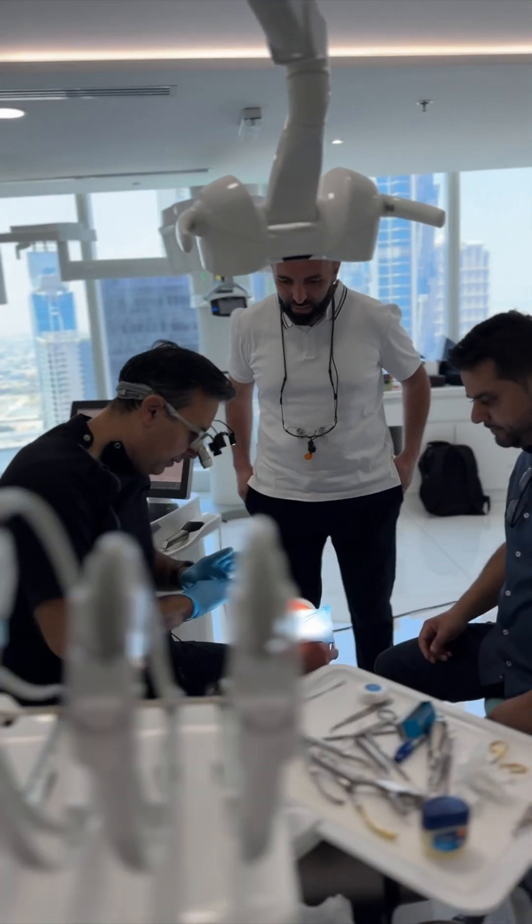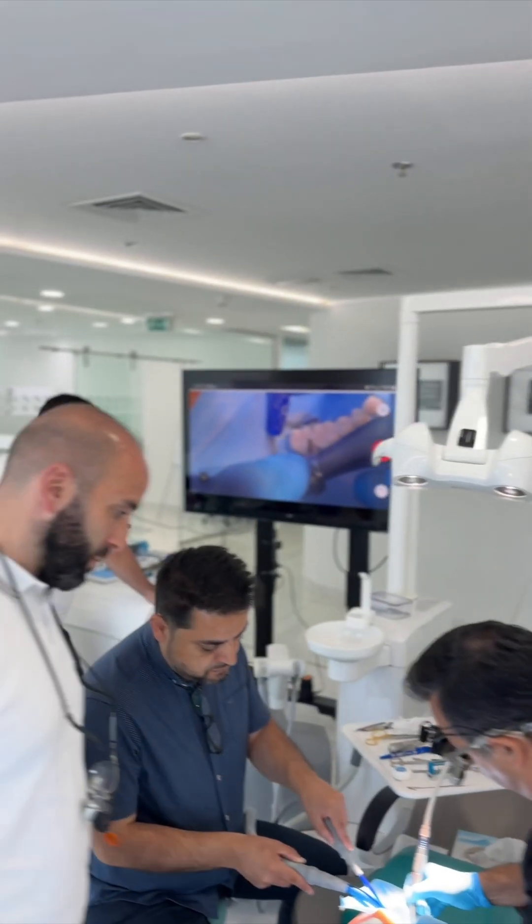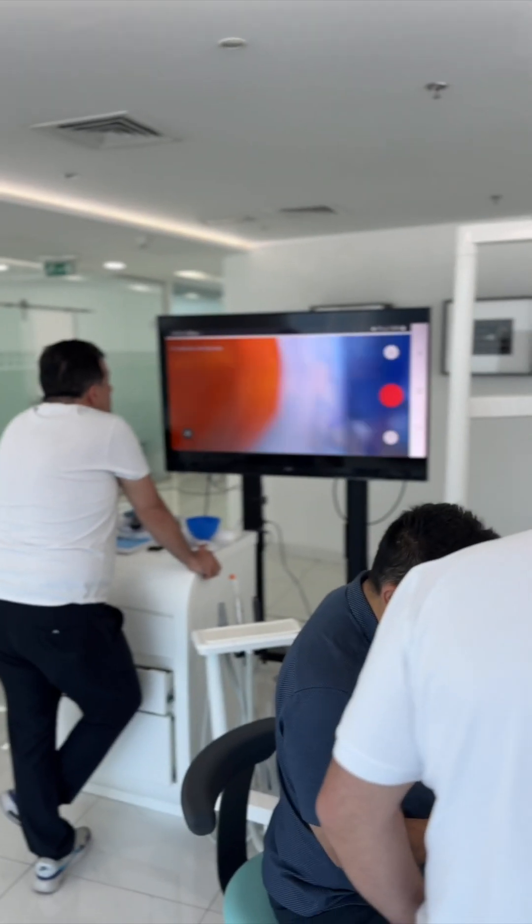Now everything is isolated. You can check it because otherwise you have under-reduction. This is also the reach of the next two pieces.